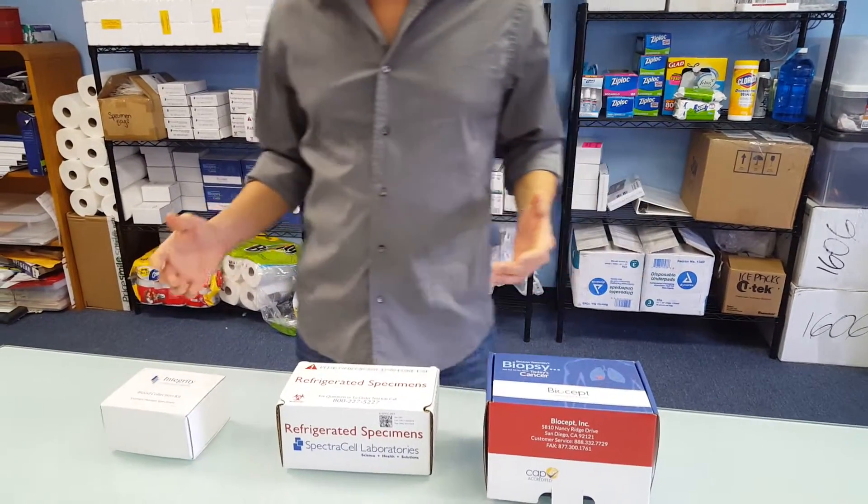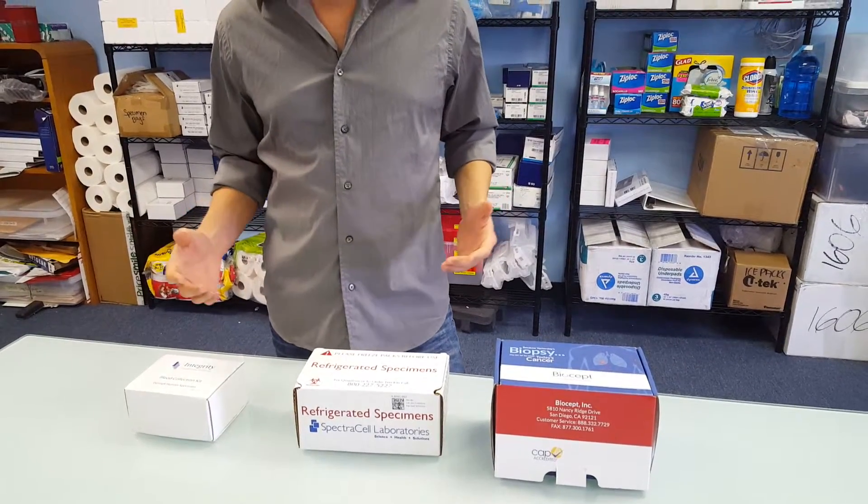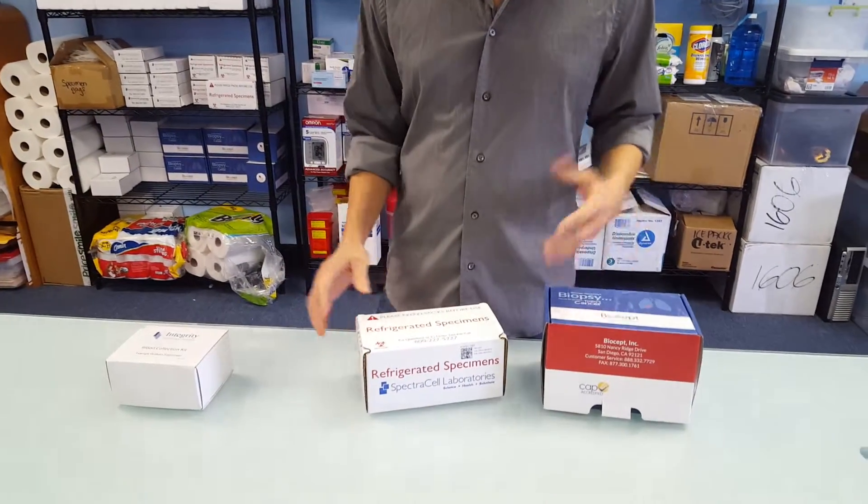Hello, so today we're going to show an example of three great lab kits and how Phlebotek can work with you to either create your own lab kit or at least direct you to what you need to create one yourself.